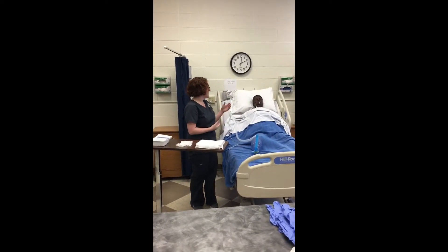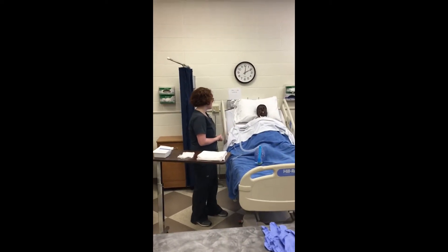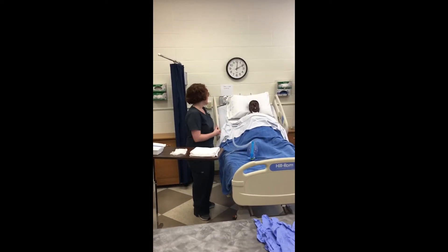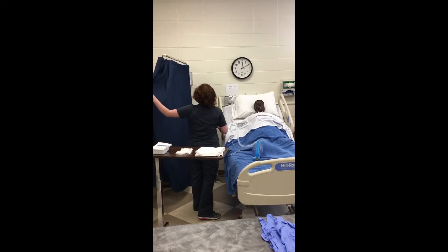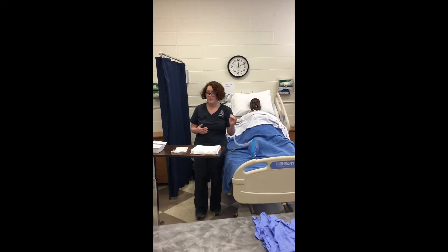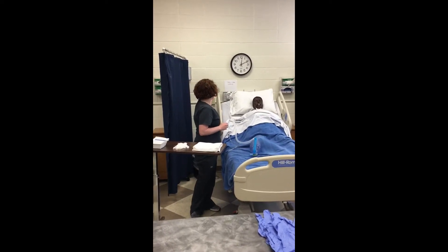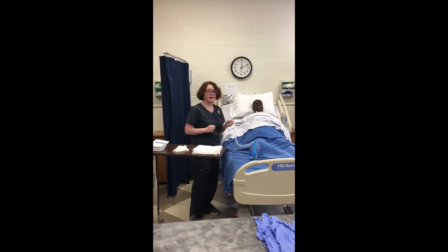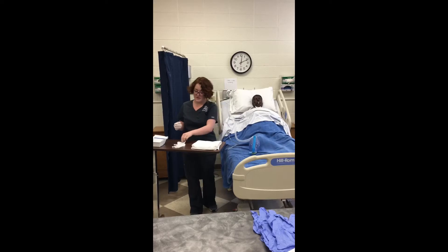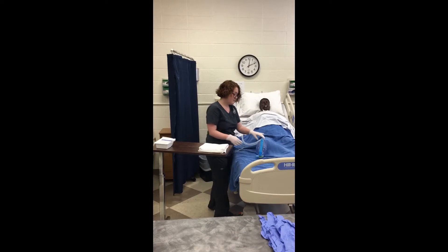Then I'm going to go into the patient's room, introduce myself, identify the patient with two identifiers, explain the procedure and why we're doing it, and provide for patient privacy. I'm going to put them up into a semi-Fowler's position. Then I'm going to turn on the suctioning to 80 to 120 millimeters of mercury, perform hand hygiene, and don my gloves. I'm going to hyper-oxygenate the patient.